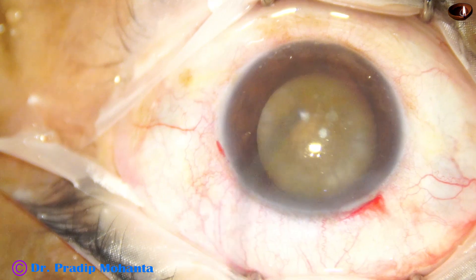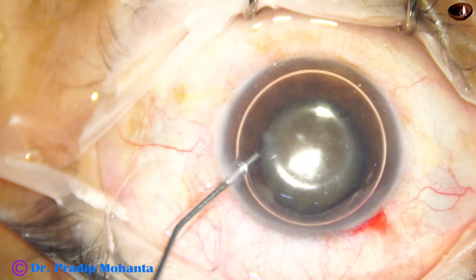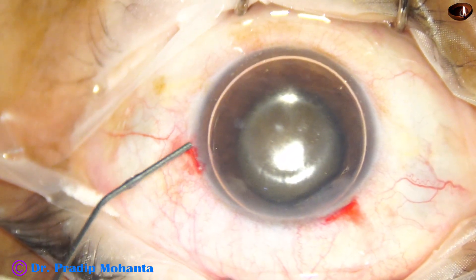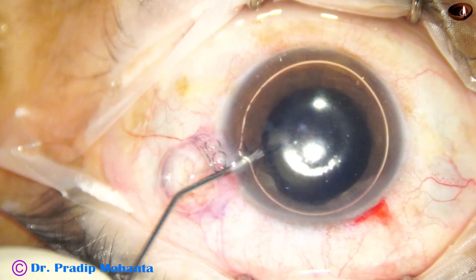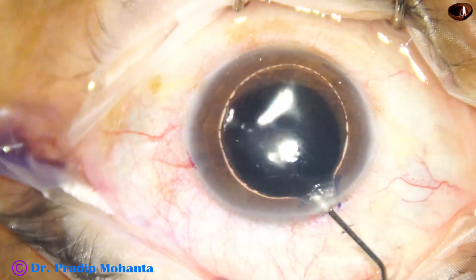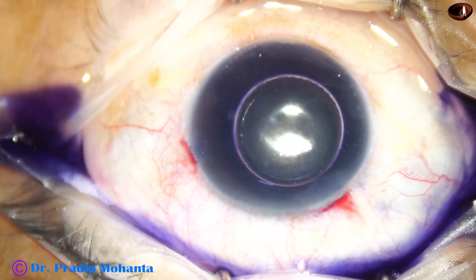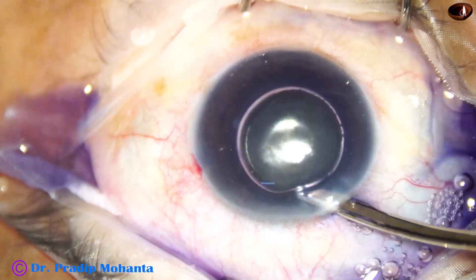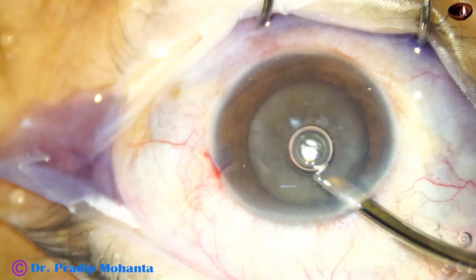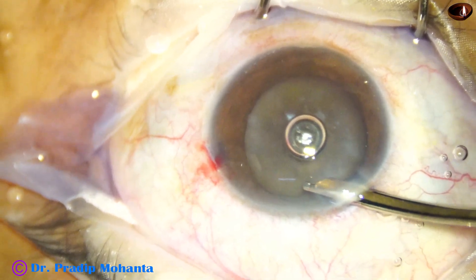An air bubble is injected to fill out the anterior chamber. Trypan blue dye is taken and applied over the anterior capsule. A little bit of adrenaline is injected to see if the pupil dilates a little more, or at least the dilated state is maintained. The dye is then washed out with BSS.